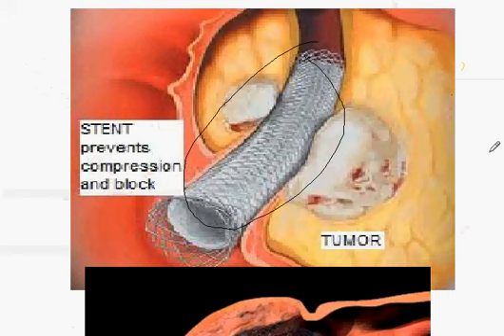So now, what about the risks of using the gastric stent? As with any endoscopy, you have a risk of bleeding, of perforation, of pain, and now you have a stent there. There is no obstruction. The pylorus is not applying its function of obstructing the stomach when there is no food insertion into the duodenum.